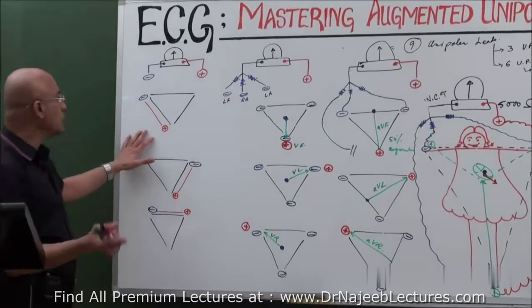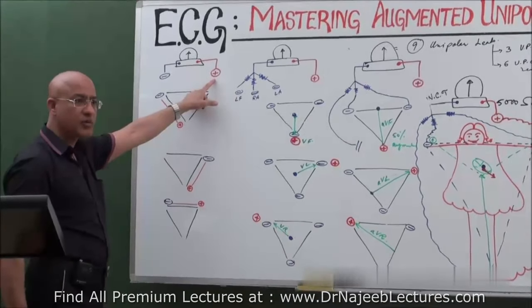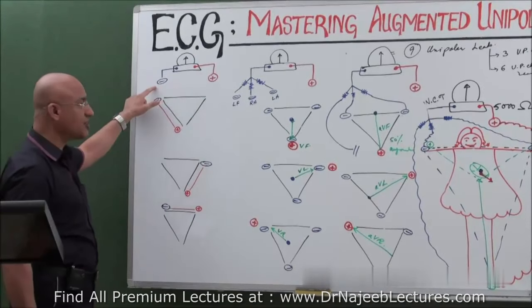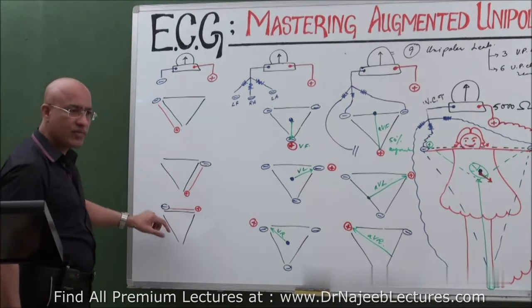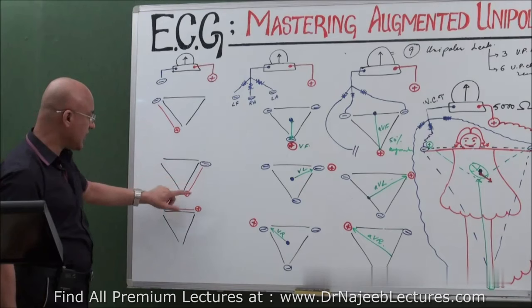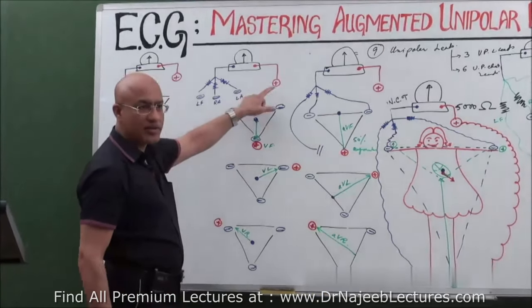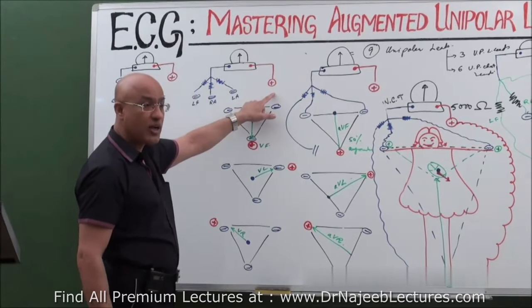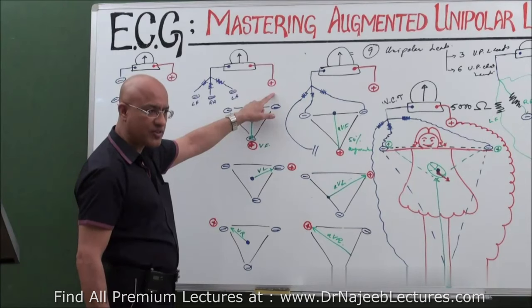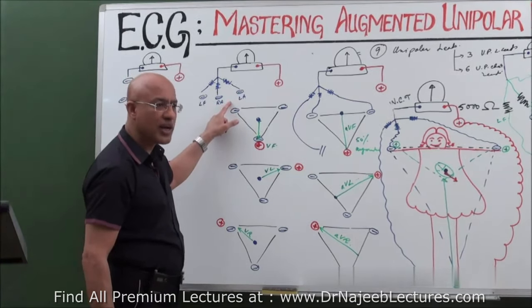In this way, now we have unipolar leads and bipolar leads. Bipolar leads, you know already, right? Where positive electrodes are detecting the potential difference referenced against the negative electrode. These are bipolar leads: 1, 2 and 3. Clear? Then unipolar leads. Unipolar leads are when the positive electrode or exploring electrode is detecting the potential difference at a site referenced against an indifferent virtual electrode.